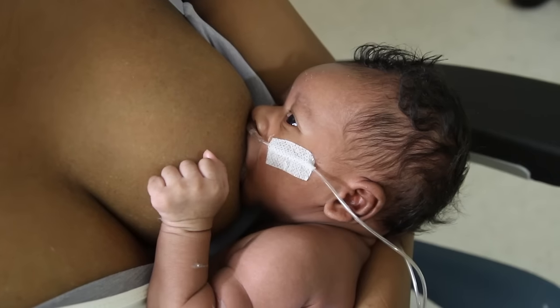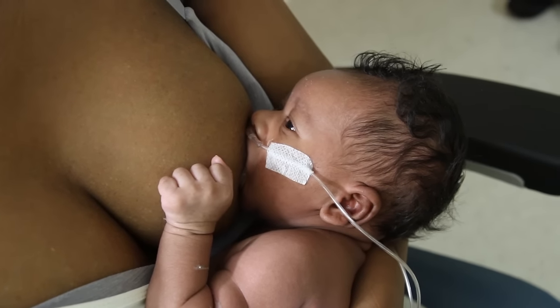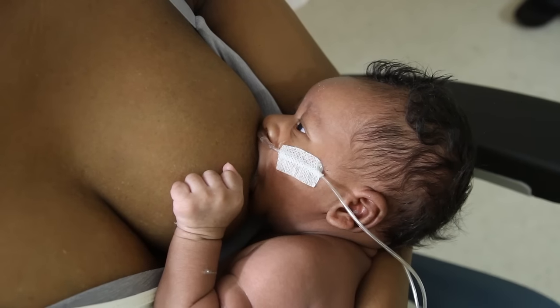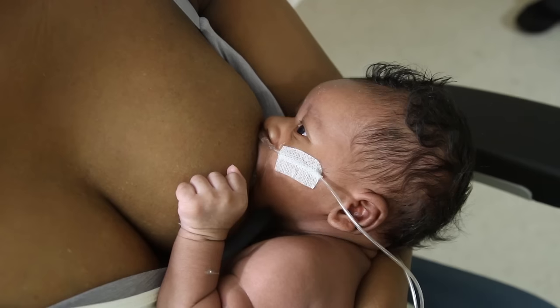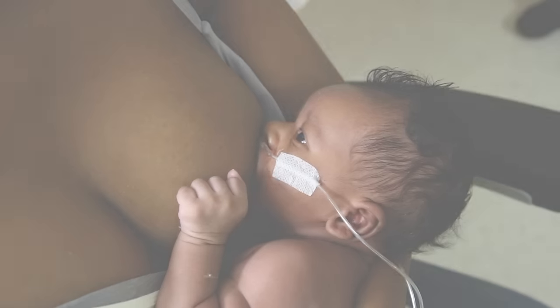Test weights are important because the medical team and families can rely on them to determine an accurate breast milk intake assessment. Babies may be allowed to start breastfeeding earlier if the volume of feeds can be reliably determined. Earlier breastfeeding increases the likelihood that breastfeeding will be established and helps to increase milk supply.